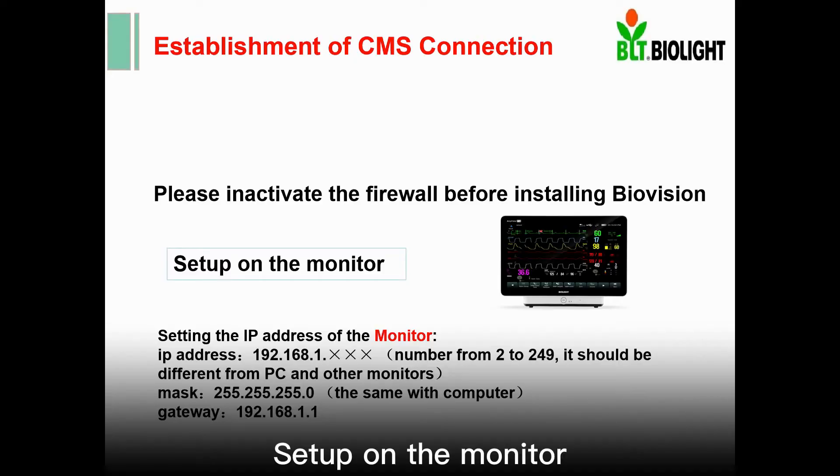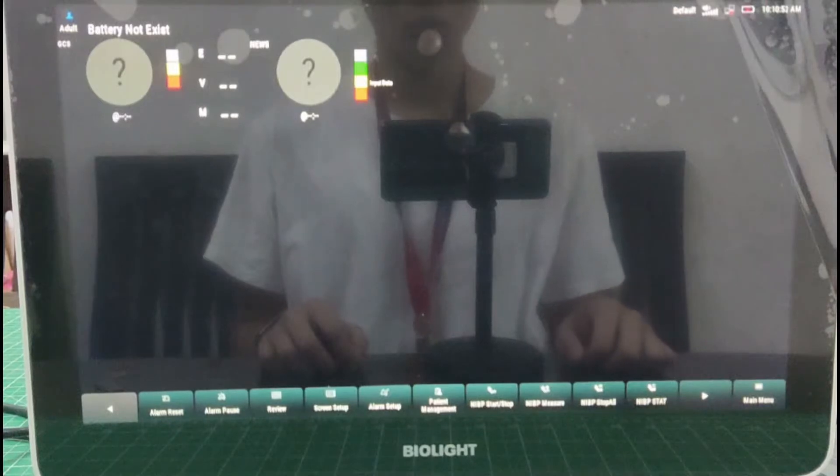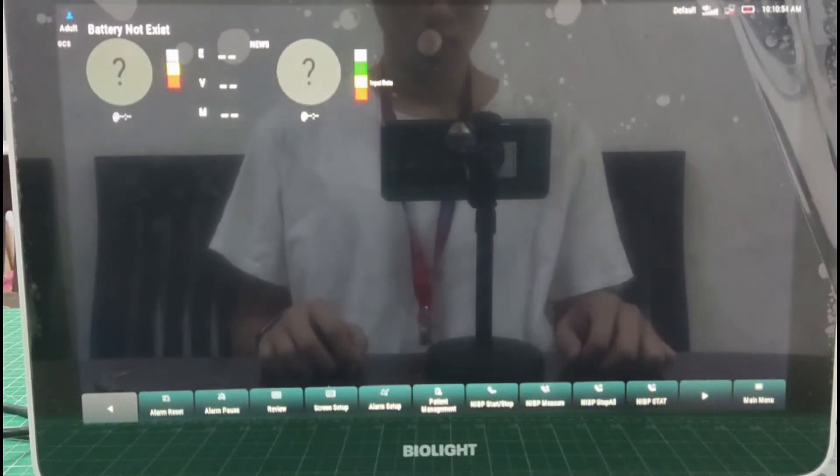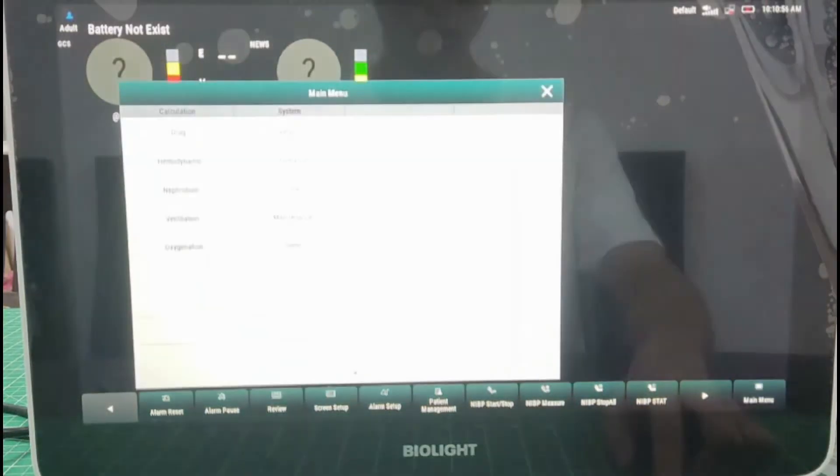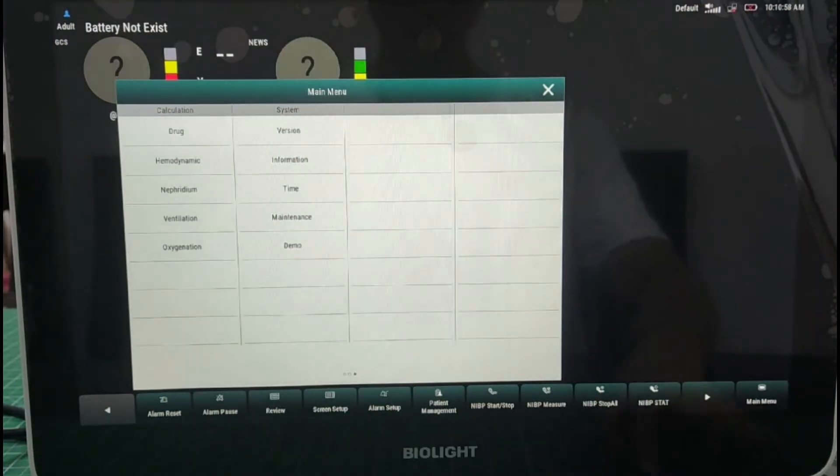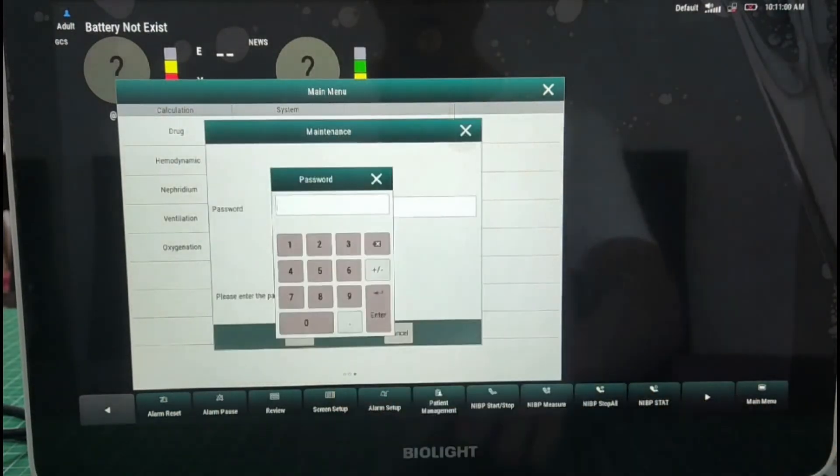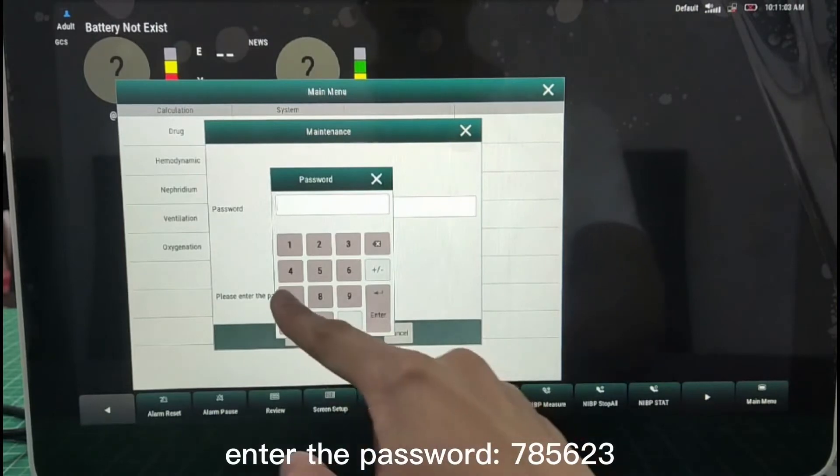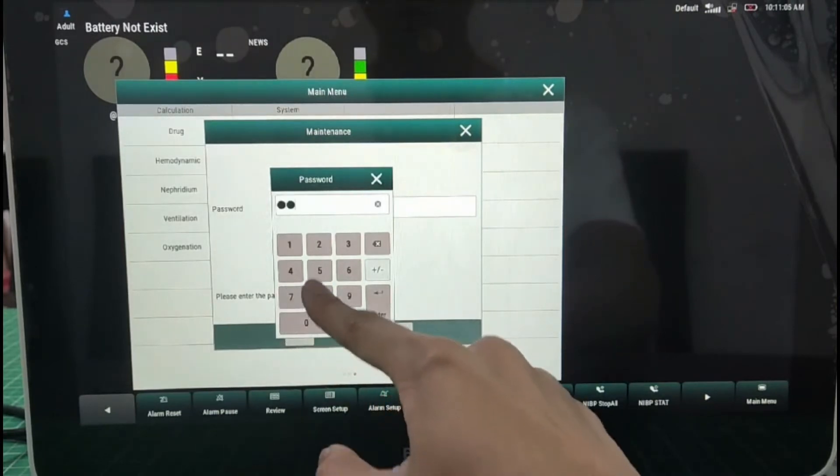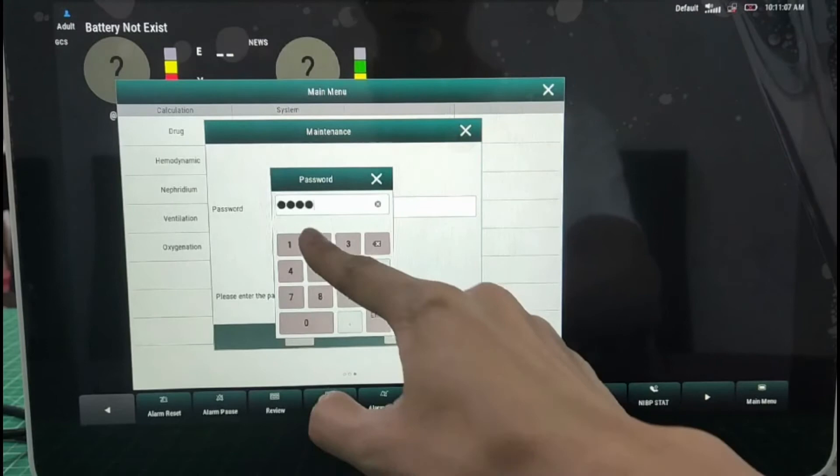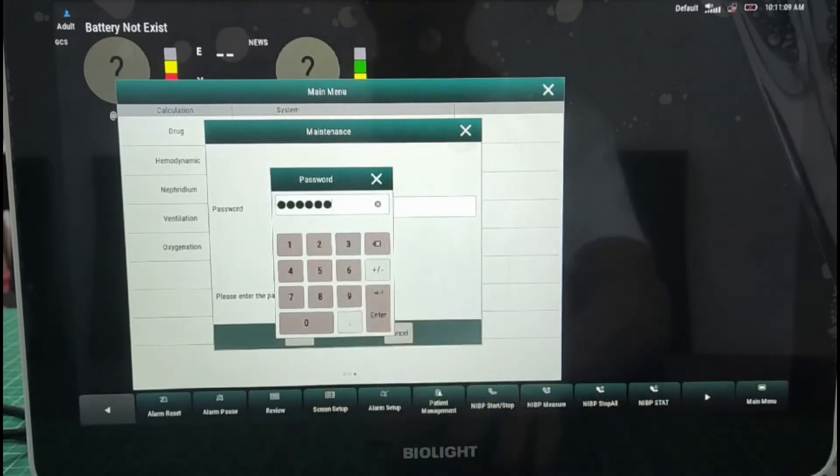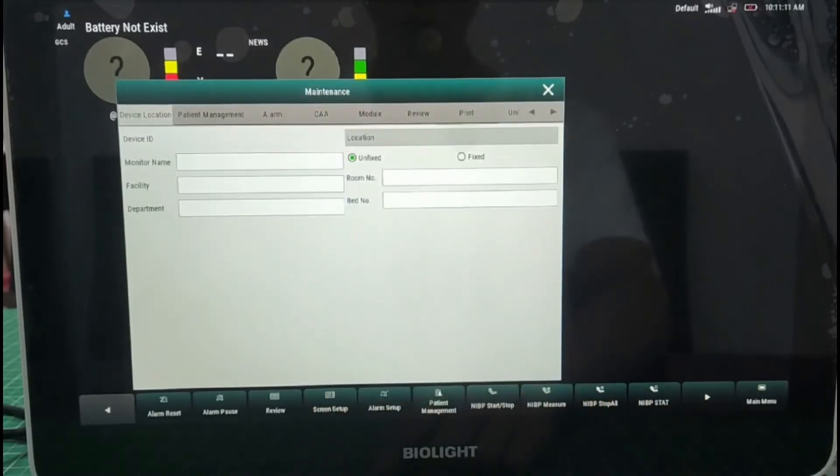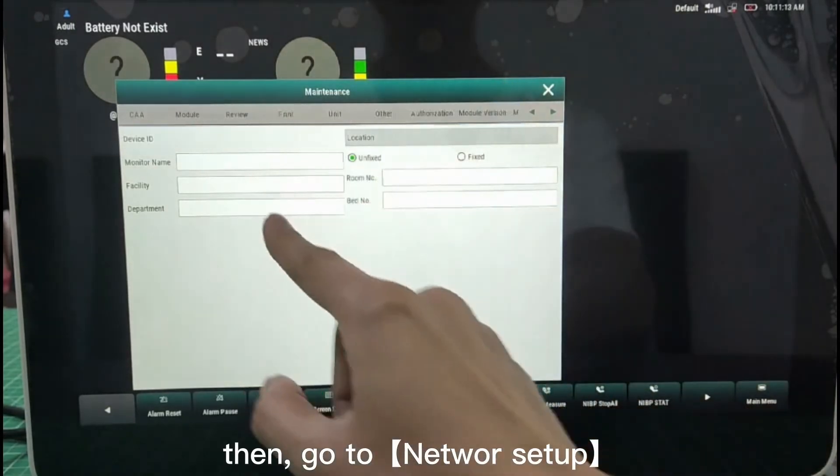Set up on the monitor. Press Main Menu button. Go to Maintenance. Enter the password, 785623. Then go to Network Setup.